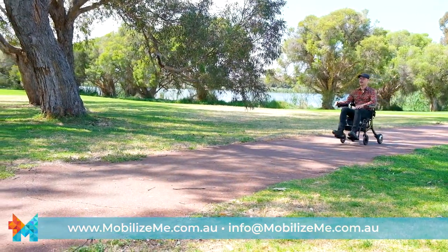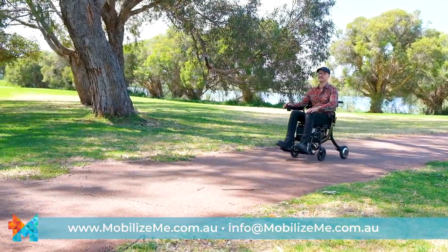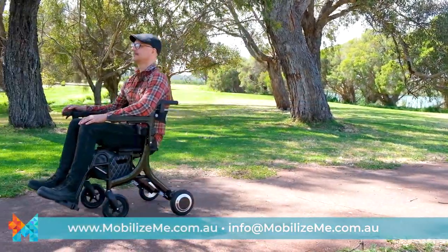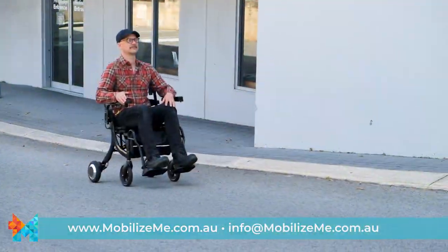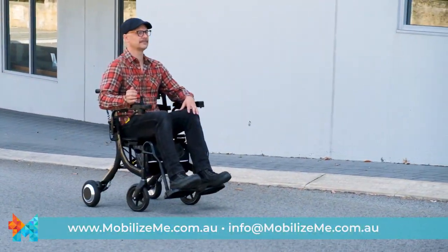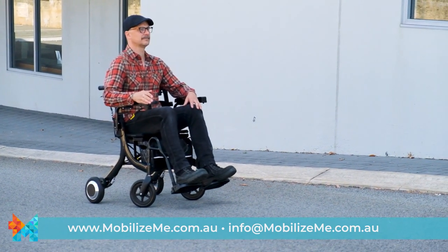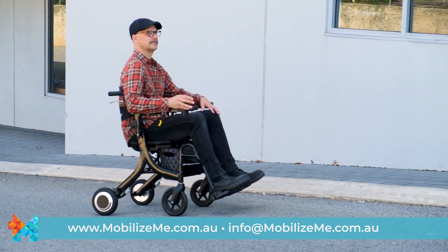Of course, the user can choose to operate the Evo themselves by turning on the joystick controller and having full independence of their travels. No matter if you use the Evo as a push-assist manual wheelchair, electric wheelchair or electric rollator, it is packed with features ensuring comfort, convenience and easy usability.